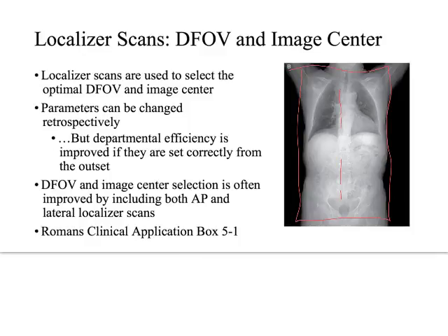What I'm talking about is if you look on page 41 on this lateral view, he's got a very flat hemidiaphragm. He does not have these costophrenic angles, but if you can imagine that rear part of the lung where it dips down, if it dipped really low, I don't want to clip that. If I'm doing a chest CT, I want to make sure to include all of that.